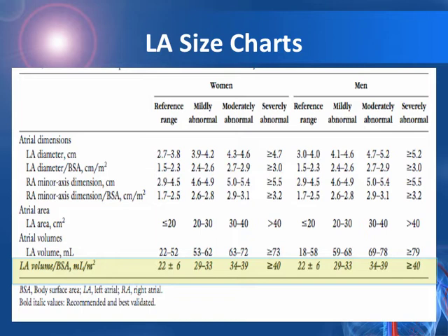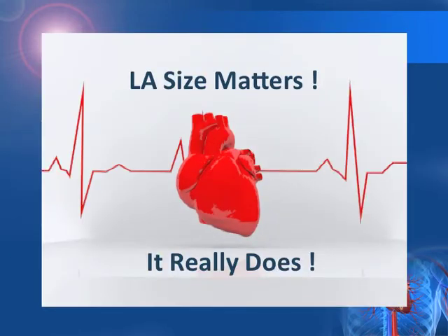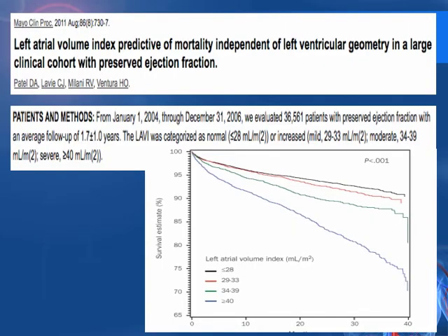And above 40 is severely enlarged. Now let's see if it does matter, if the size does truly matter. In this study from 2011, 36,000 patients were followed with a preserved systolic function, and their survival was monitored.